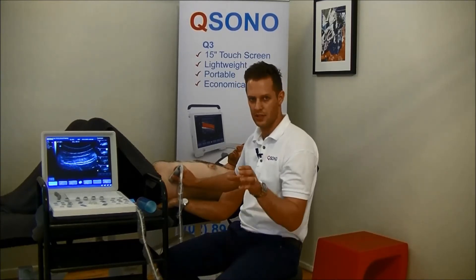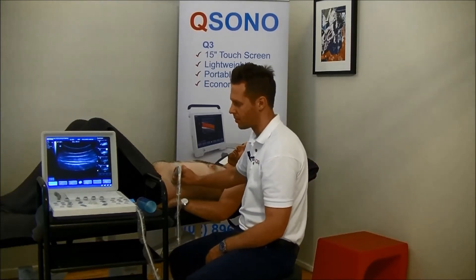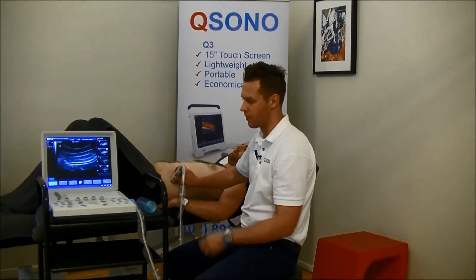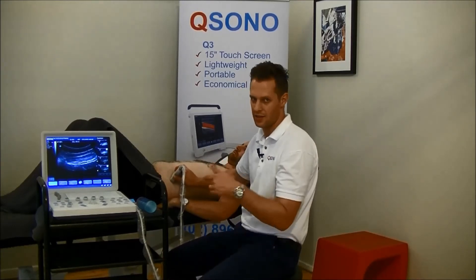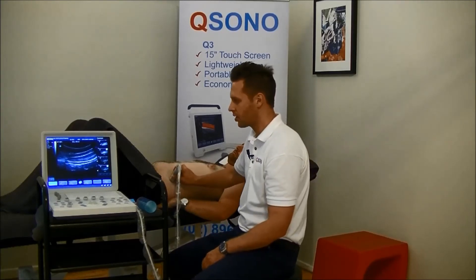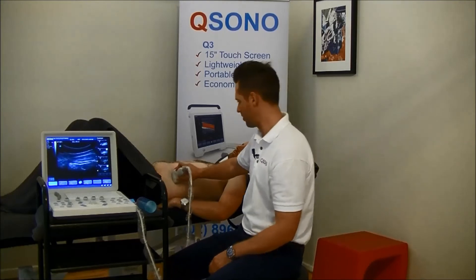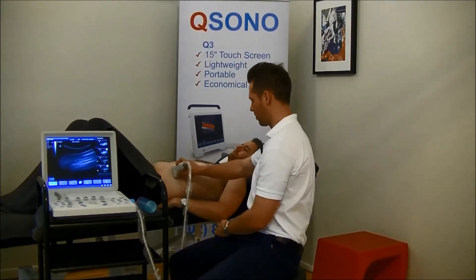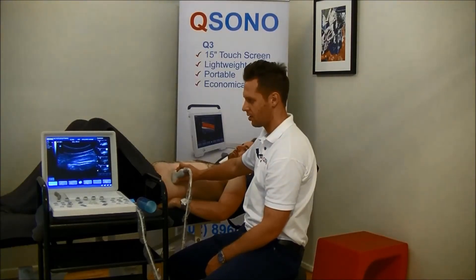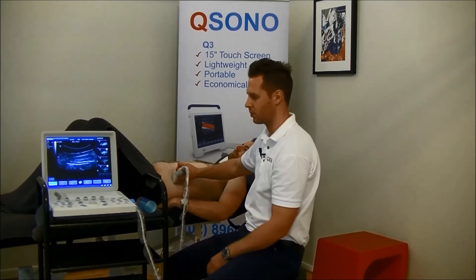The other thing we're interested in is does the transverse abdominus slide? Because for some people with chronic lower back pain, their transverse abdominus might thicken okay, but when they're doing the functional activity it doesn't slide underneath the internal oblique, so it's not functioning the way that it should in normal healthy people. The easiest way to do this is to get your probe position somewhere between the iliac crest and the bottom of the ribs, put it in the mid-axillary line, and just come across until you feel like you have an adequate picture of your transverse abdominus, internal and external oblique.